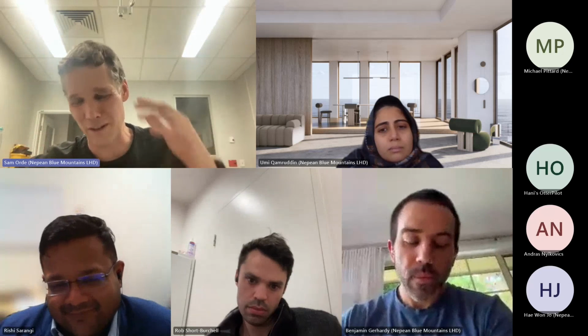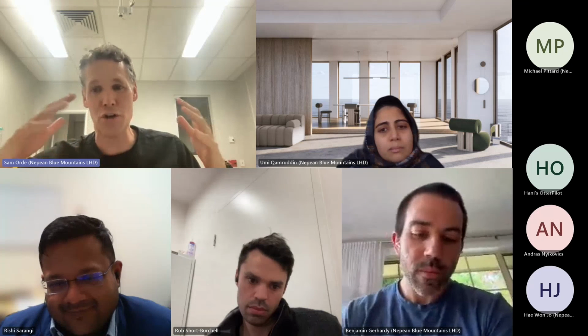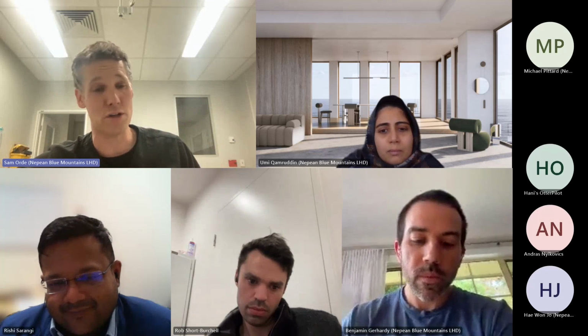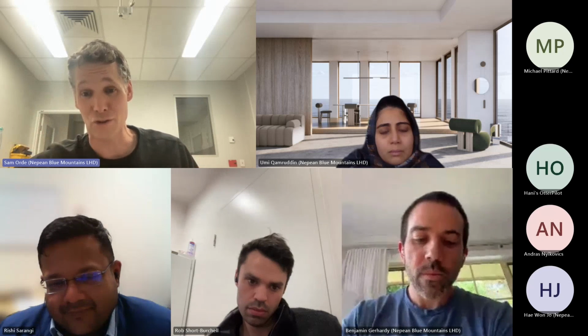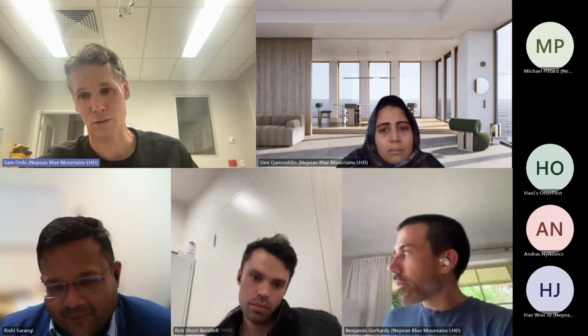One of the things I was hoping to do in this lecture, and I'm sorry I ran out of time, was show you different clinical scenarios where someone has totally weird looking LVOT VTIs despite a normal functioning ventricle, because of reduced afterload, just because we've given them an anesthetic or something.